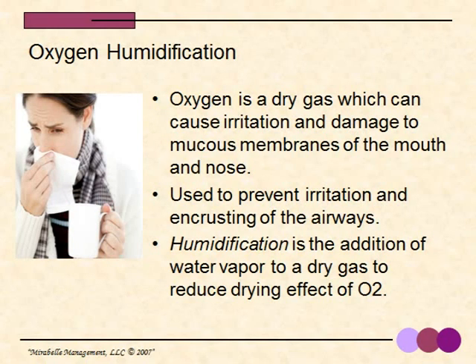In one of the opening slides, I mentioned that the doctor will prescribe the type of oxygen to be used, whether it be humidified or non-humidified. Oxygen is a dry gas, and this can cause irritation and damage to mucous membranes of both the mouth and the nose.